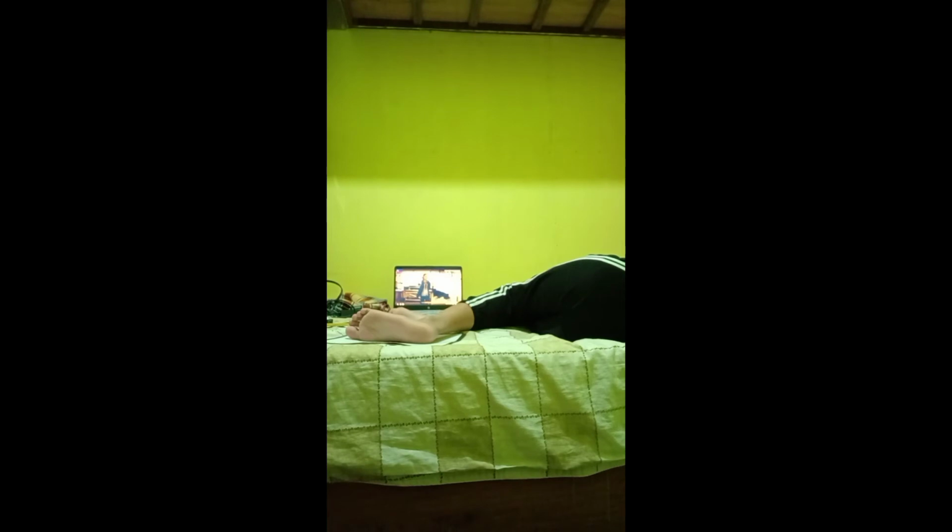It is still the same as the lateral projection mediolateral. This projection demonstrates the entire foot in profile, the ankle joint, and the distal end of the tibia and fibula. Distal end of the tibia here, then distal end of the fibula.